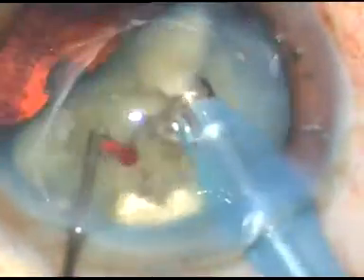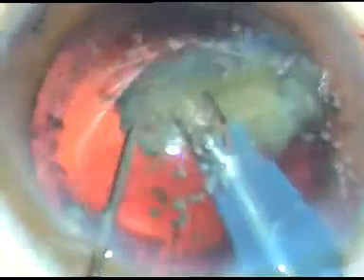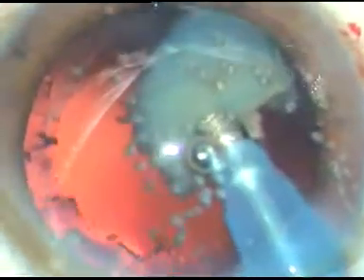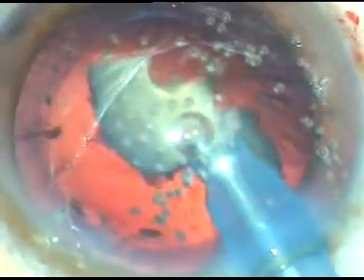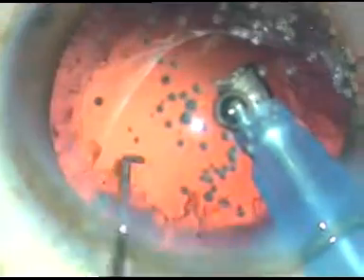Each part is being emulsified and removed. Phaco power used in this case is 75%. Flow rate is 45 milliliters per minute. Vacuum is 450 millimeters of mercury. This is the Oertli Cataract 3 phaco machine. Now, this is the last fragment. For the last fragment, you can use a posterior capsule protector — PCP — or you may remove the chopper, prevent the leakage through the side port, and confidently emulsify the last nuclear fragment.